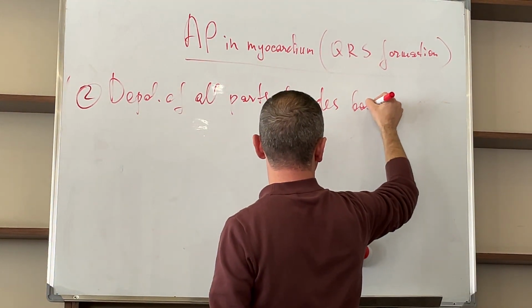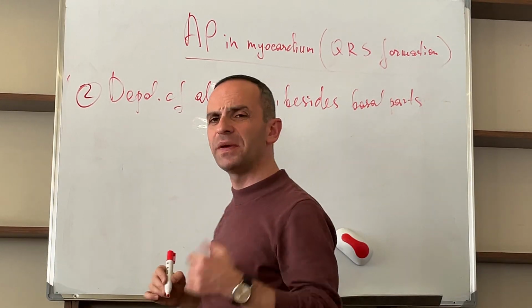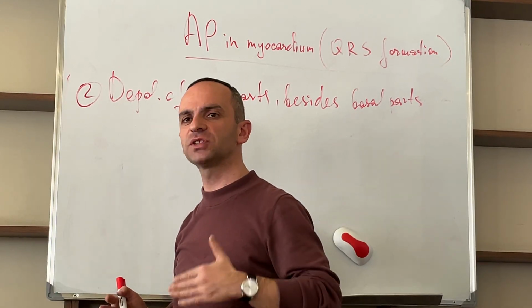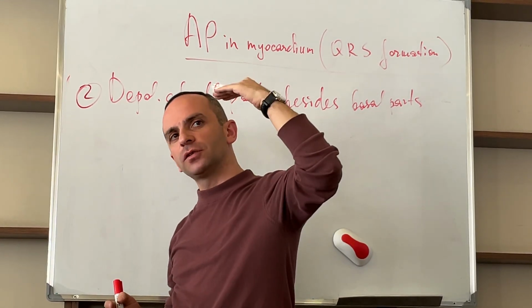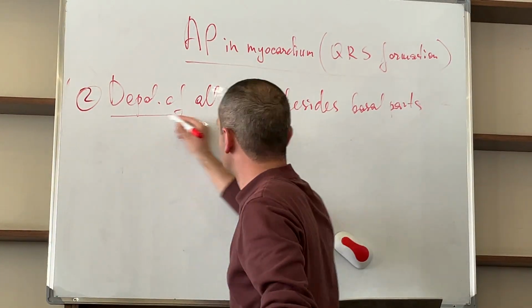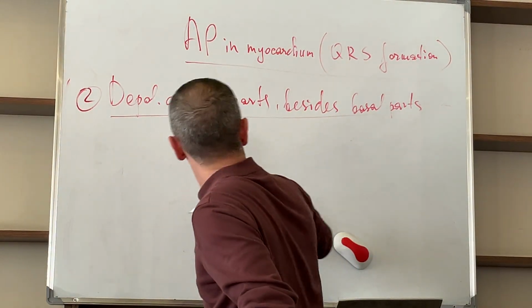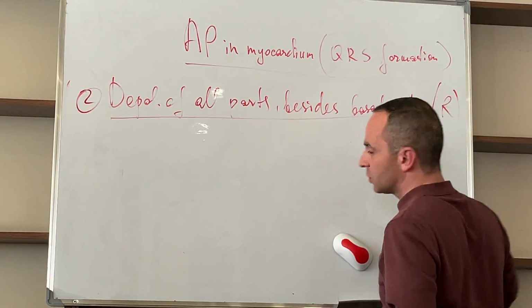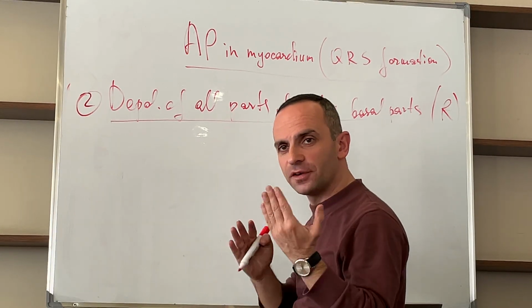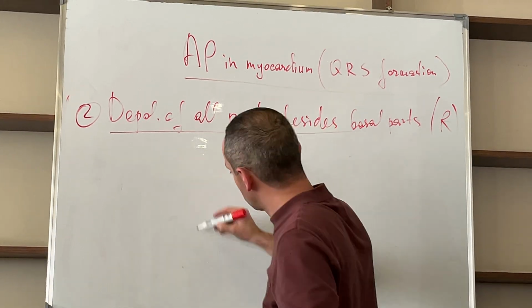Pay attention, it's not the base of the heart, but the basal parts of the ventricles. The base of the heart has the opposite direction, like the top of the atria, because the opposite side is the apex. In other words, we need R formation. Look, the same vector in one lead was R, in another lead was Q.